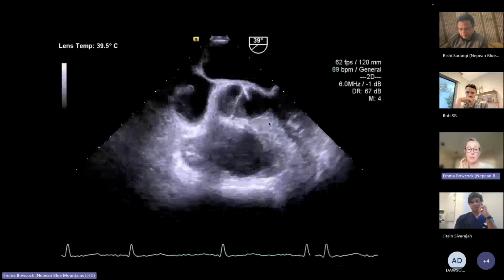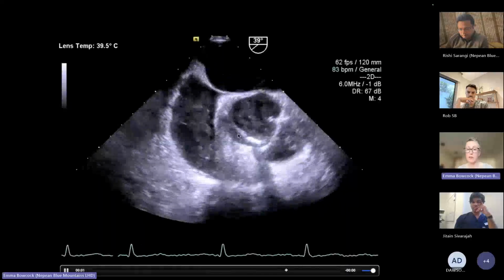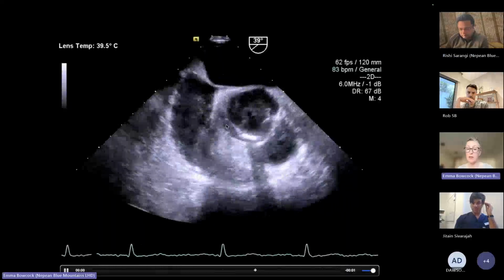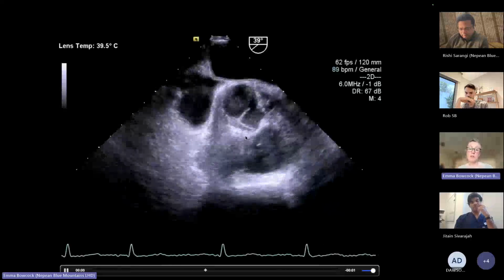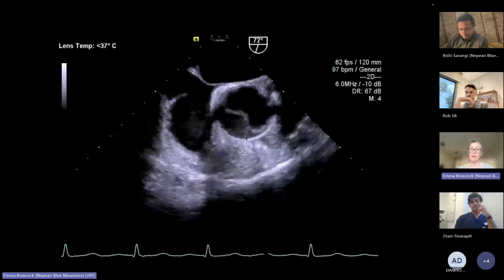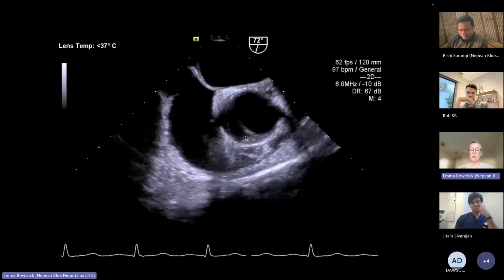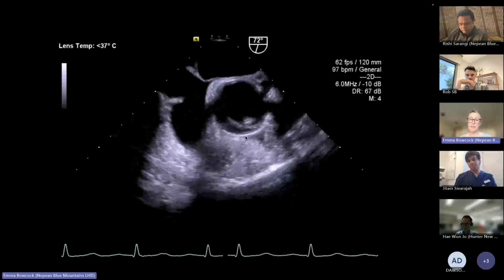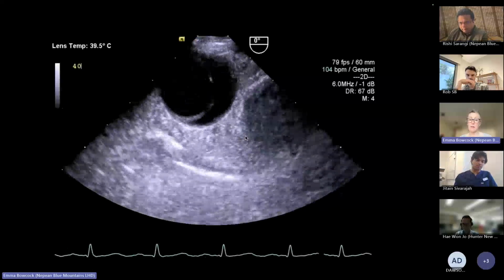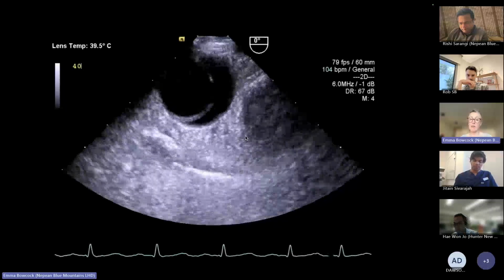This is short axis of the aortic valve, slightly off axis, but showing that awful dissection flap, probably with a bit of layered thrombus in the lining of that intimal tear that you can see. Again, pulling up and going round, so this has gone from the RV inflow view because you're now at 70 and you've pulled up a little bit to be in the proximal ascending aorta, and you can see that awful dissection flap extending all the way up, and then the descending aorta showing the dissection flap and the true and false lumen.